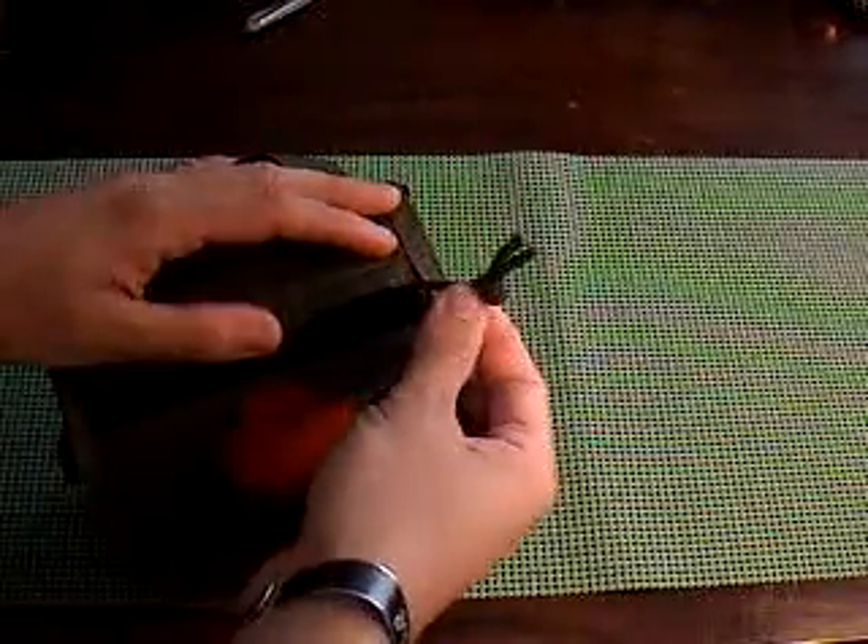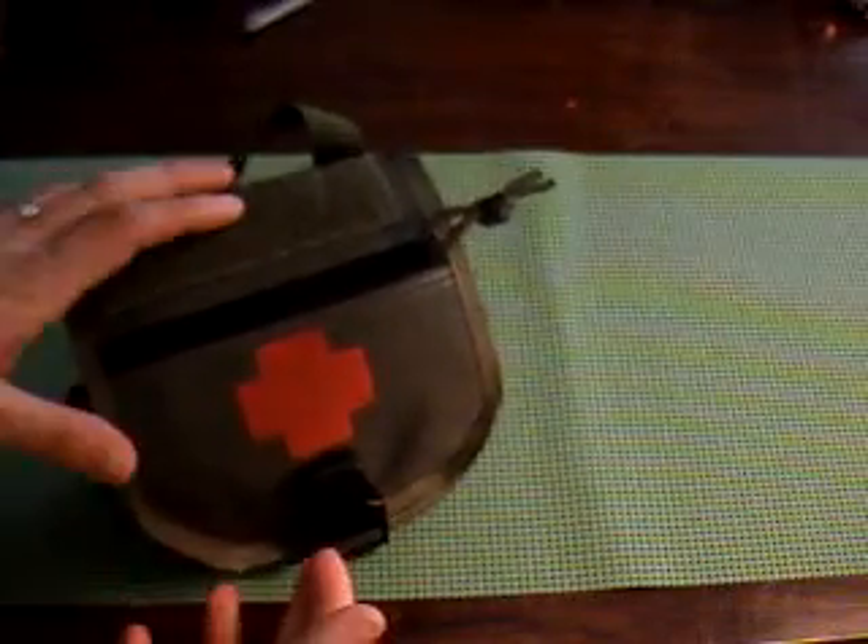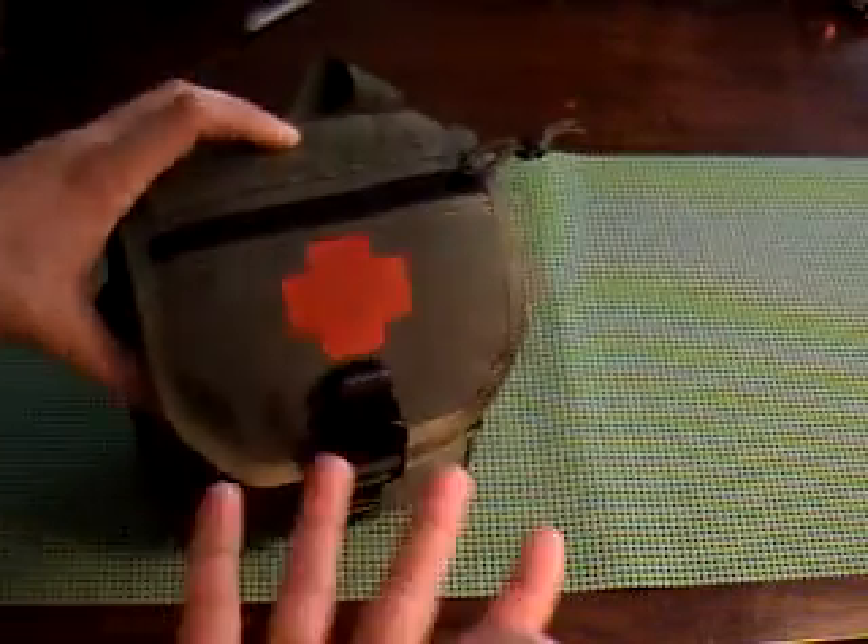All those zippers came with pull tabs on them — I really like that. First off, it's Maxpedition, so quality has spoken for itself. It's good quality.